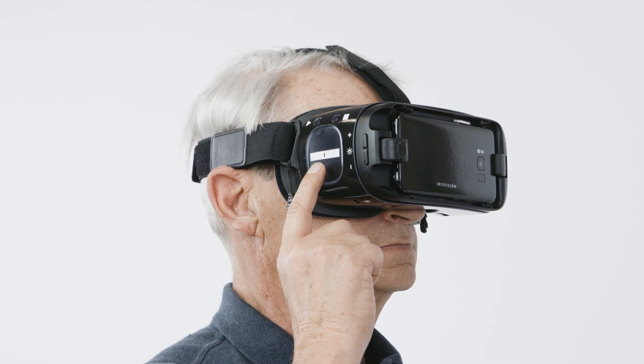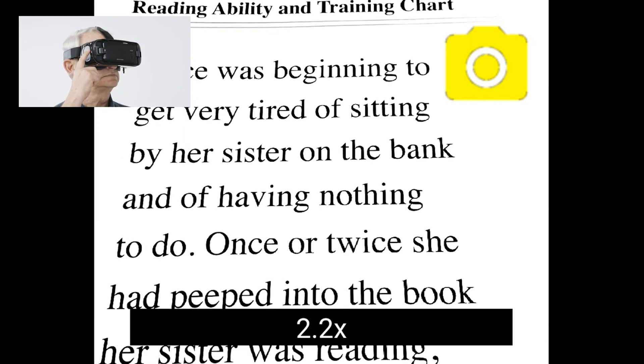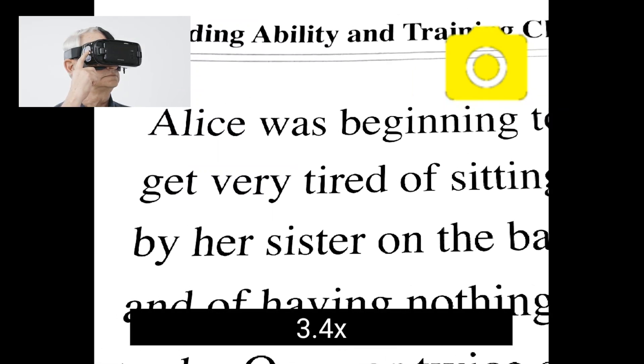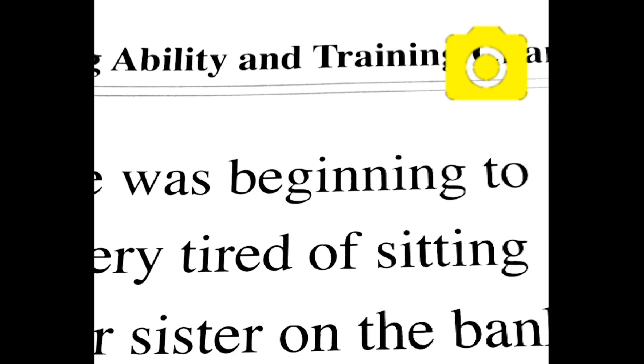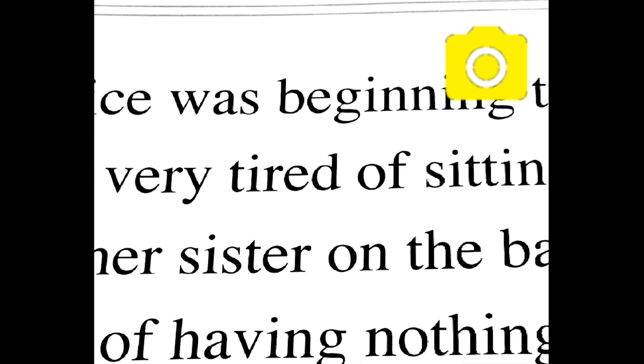Swipe your finger towards your ear in order to zoom in. Once you are zoomed in, less of the screenshot will be visible. In order to view the rest of the image, you will need to physically move your head left, right, up or down.